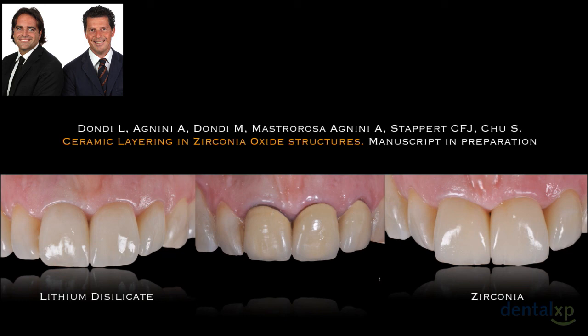Because what we think is that if you work with a high quality zirconia and if you have a correct protocol step by step for layering the ceramic onto the zirconia core, you can obtain the same aesthetic result as, or a more aesthetic result compared to, more aesthetic materials, like for example in this case lithium disilicate.